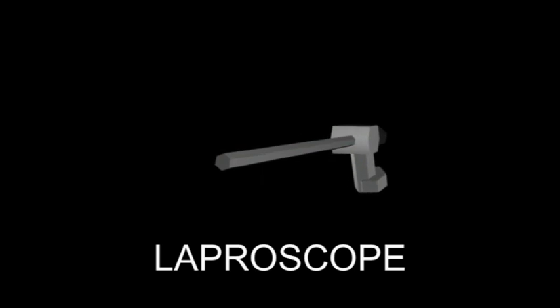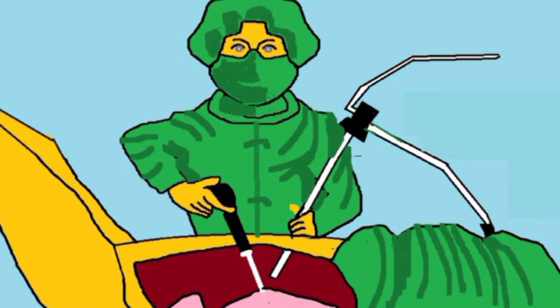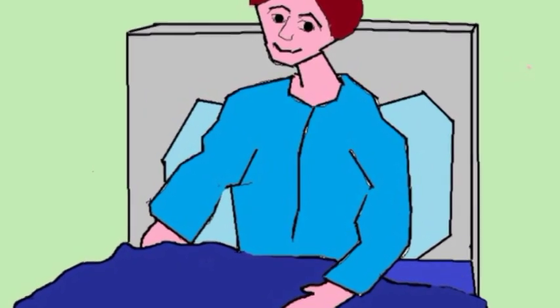With the beginning of the use of laparoscope in 1970, a breakthrough in surgery and investigation procedures occurred. Though it was rather tricky for surgeons to master a laparoscope, it was good for patients in many ways. But soon it became clear that laparoscopic intervention was not free from complications and limitations.